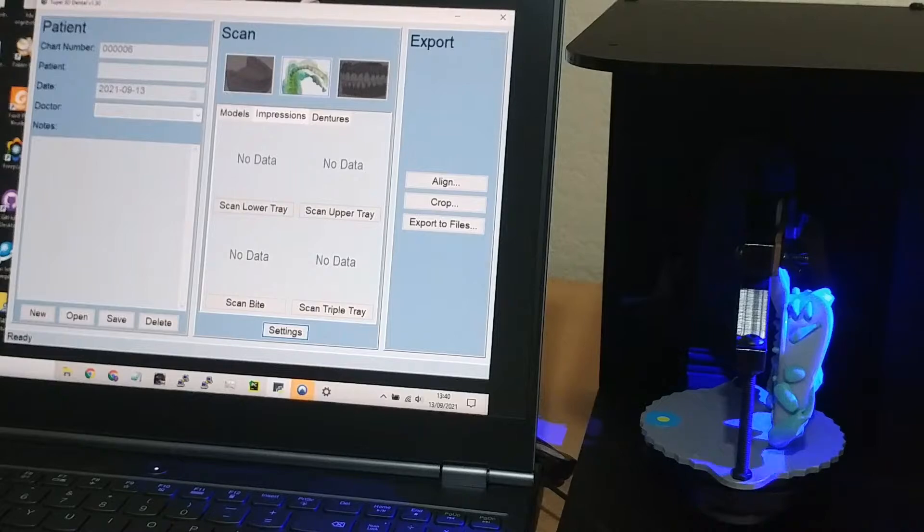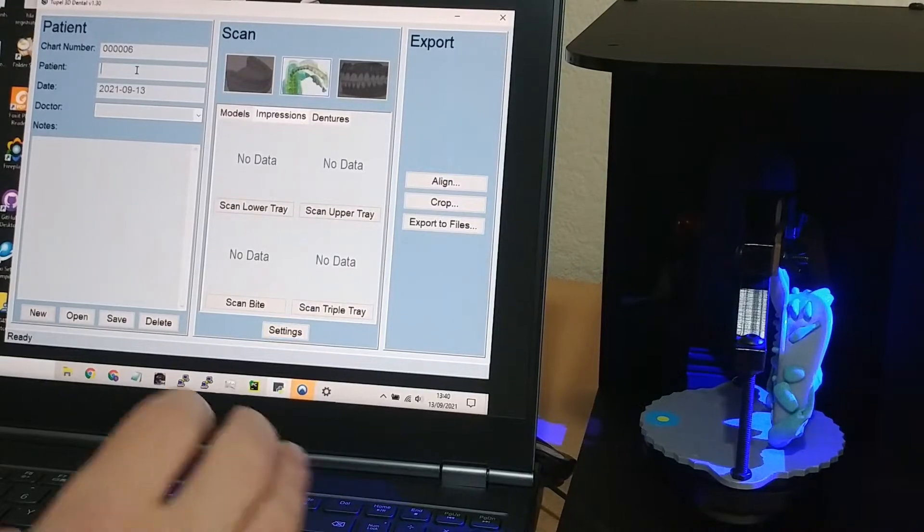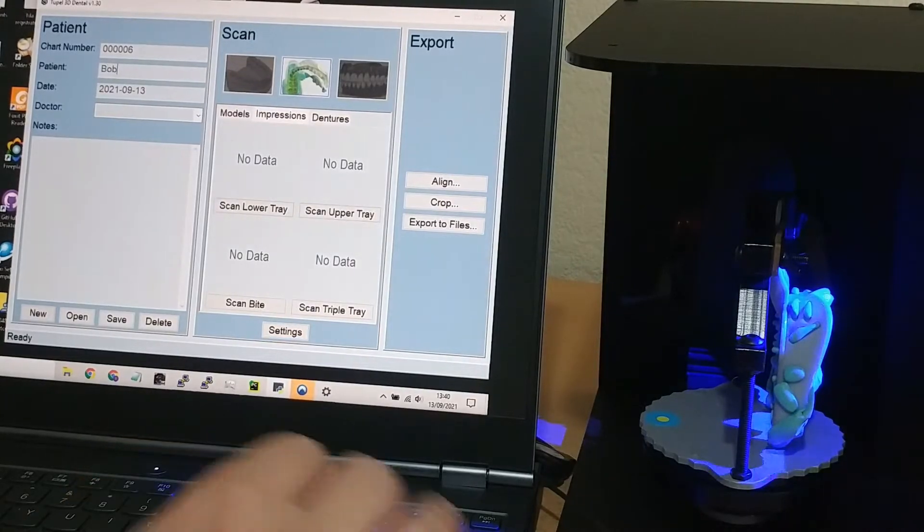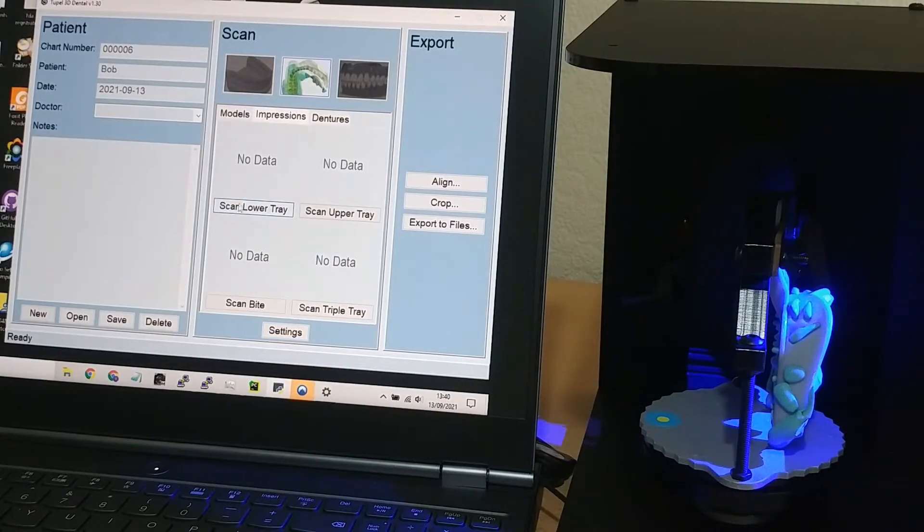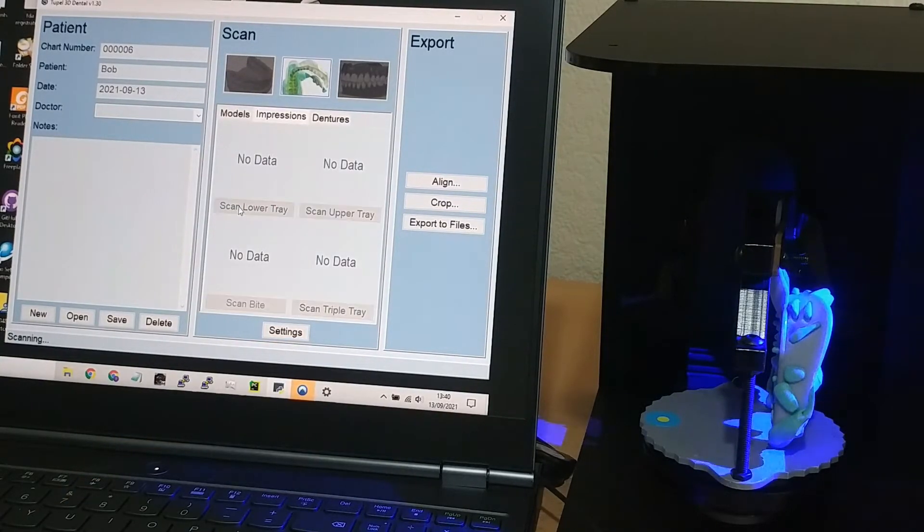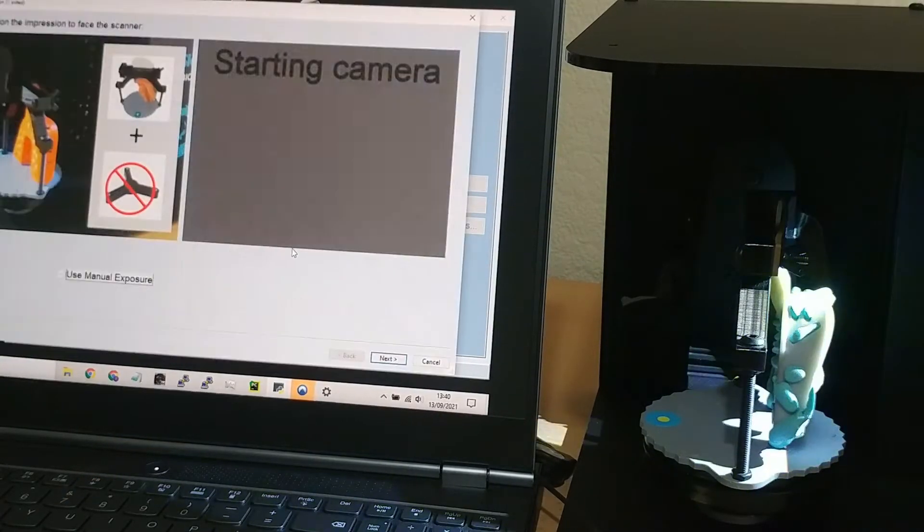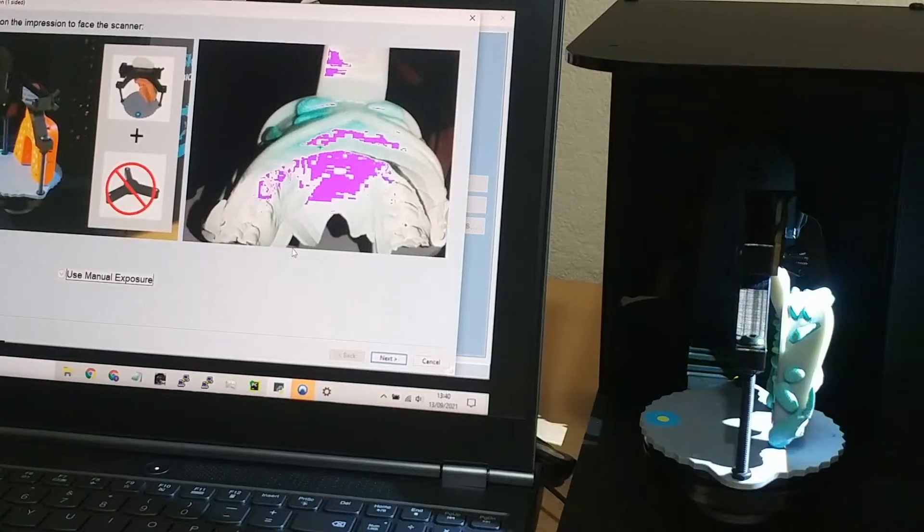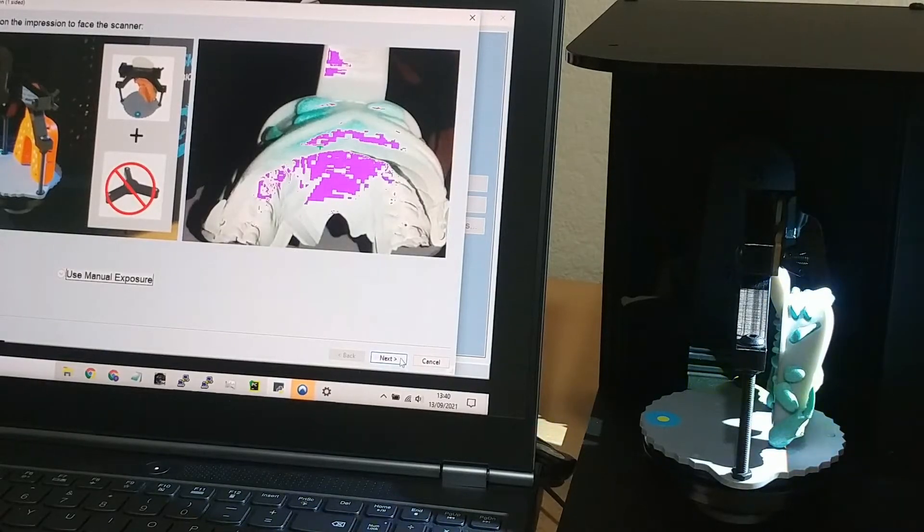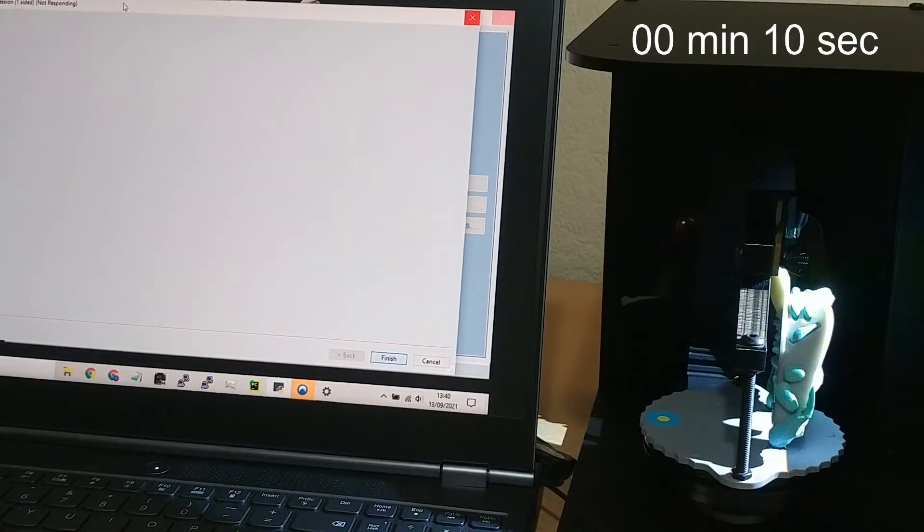So I put it in the scanner and click scan impression. It's going to take a lot of images, so I've accelerated the video.